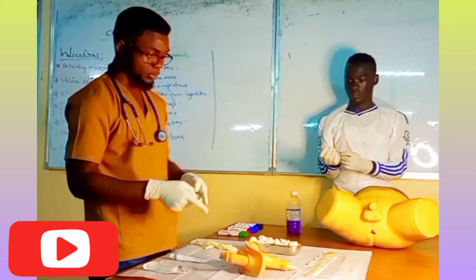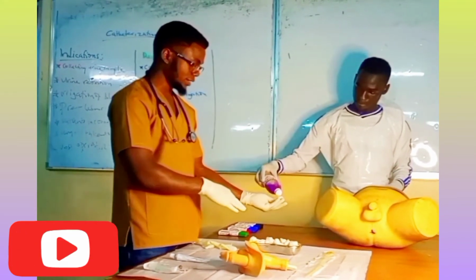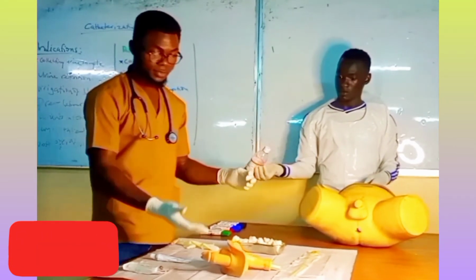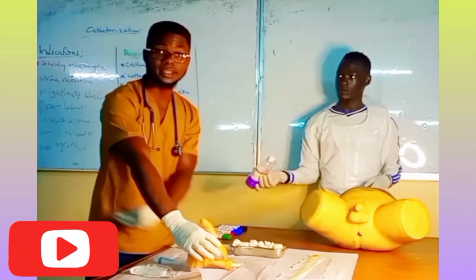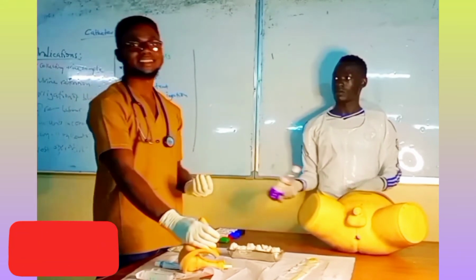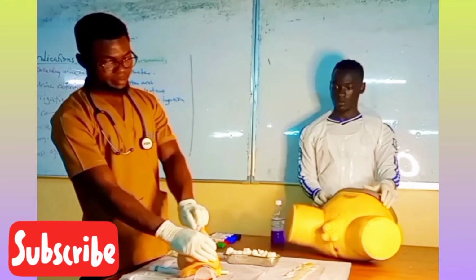So I'm starting with the model. I pick my cotton swab, then I get the disinfectant. I don't touch the bottle, to avoid cross-infection and contamination. So I hold my model. This is a man lying on the bed. I hold him like this. Are we together? Because at that time, the man is not erect, it's just like you are seeing here.